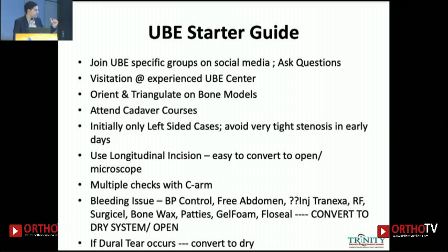I use tranexamic acid, radiofrequency, bone wax, neurosurgical patty, Gelfoam, and if nothing works, convert to a dry system or open system. And if a dural tear occurs, it's better to convert to a dry or open system.